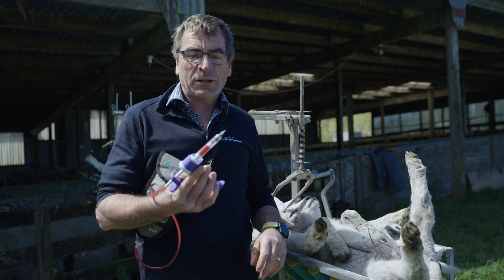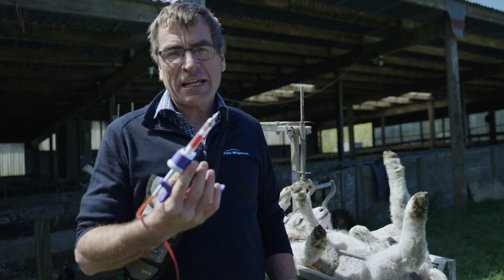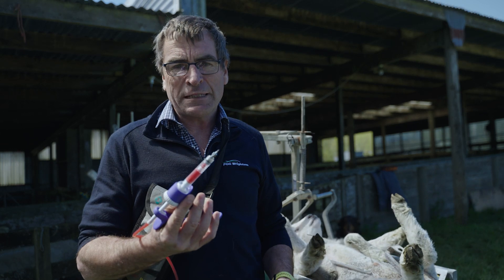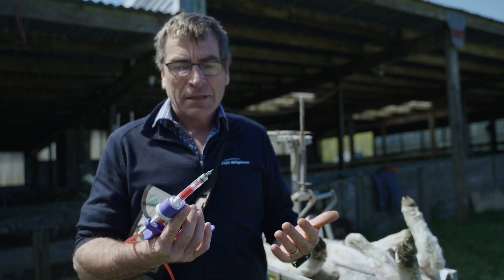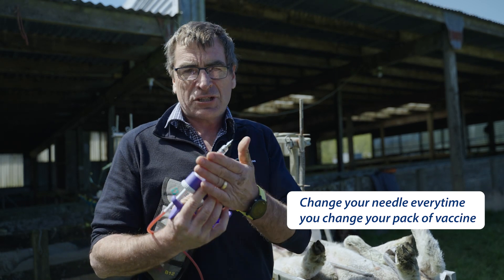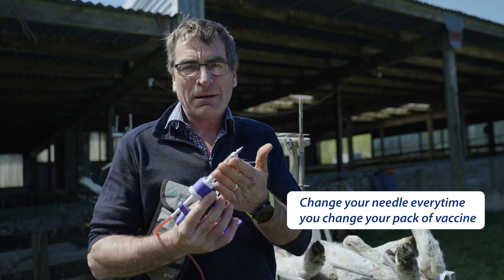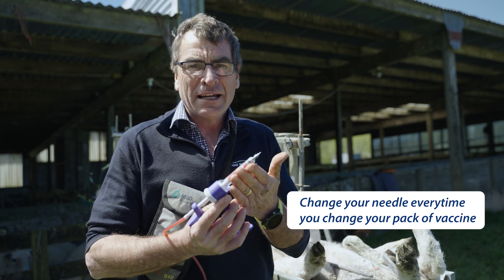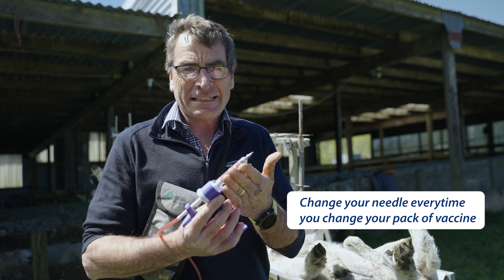A common question is when should you change the needle? I know in the packet it says every 12 to 20 animals, and that doesn't happen. So what I feel is every time you change your packet of vaccine, change your needle. It does get blunt, and a sharp needle certainly goes a long way to stop ending up with lesions in those lambs.